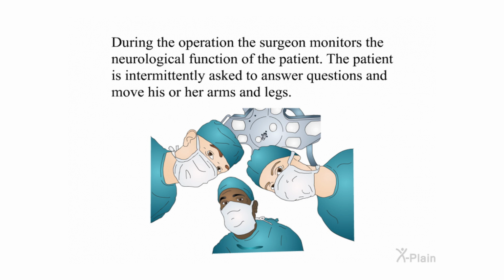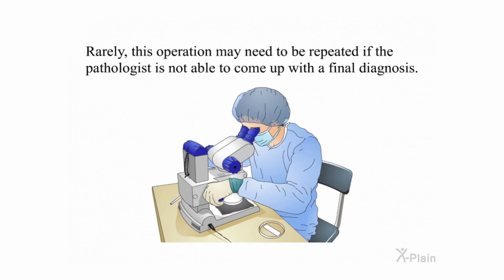During the operation, the surgeon monitors the neurological function of the patient. The patient is intermittently asked to answer questions and move his or her arms and legs. Rarely, this operation may need to be repeated if the pathologist is not able to come up with a final diagnosis.